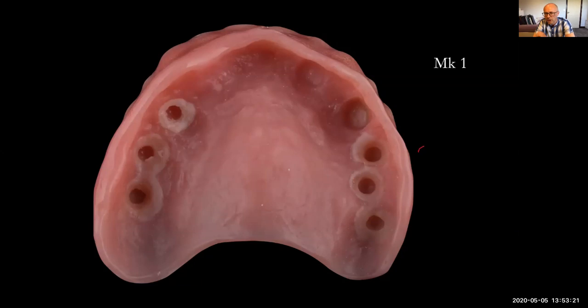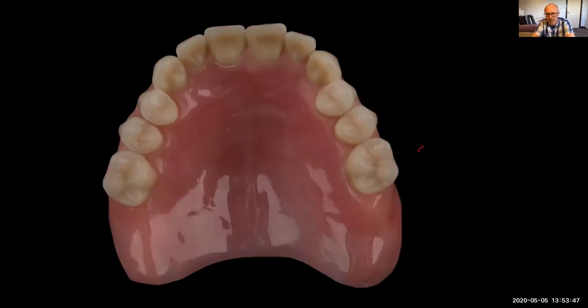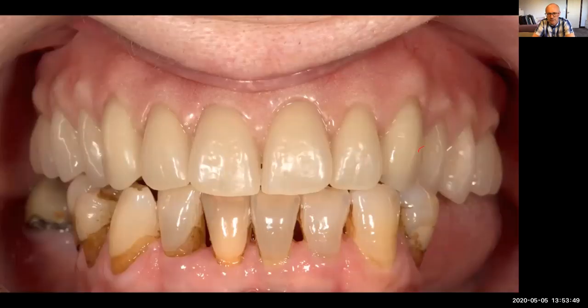And I just wanted to, because I knew she's very, very fussy. Even if we would talk with Olive now, if she was on with me here to chat with you, she'd tell you she's dead fussy about the aesthetics and every detail. So here we are. It's Mark 1, and this was just for her to wear, just as a temporary. We've got Moloplast B. This is a silicone material, and then she could wear that. And then off she went.